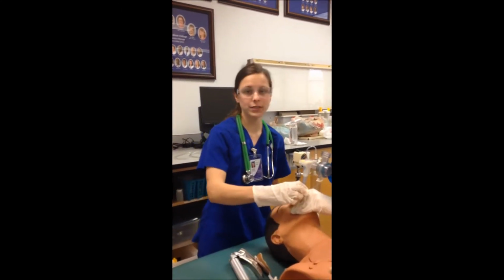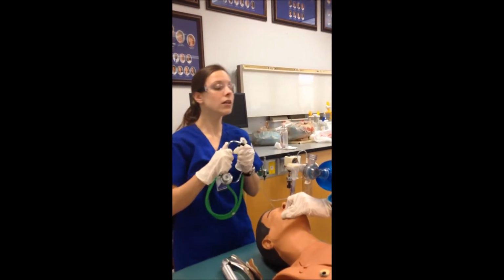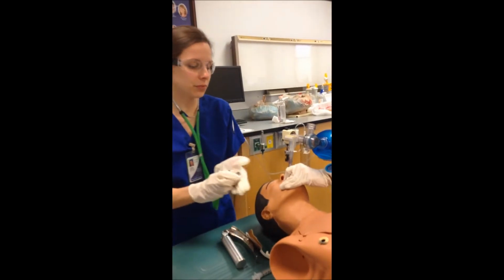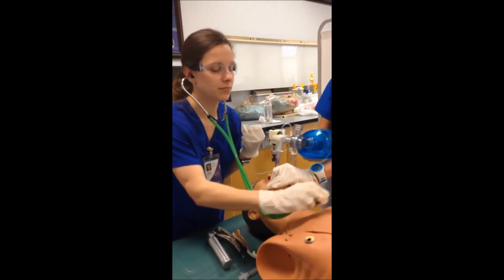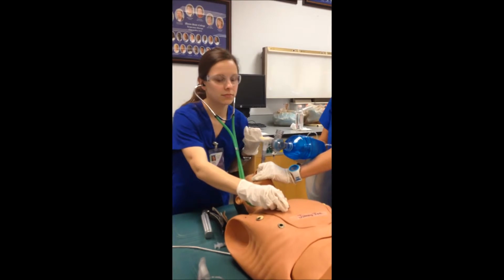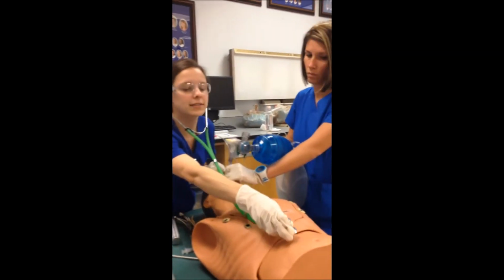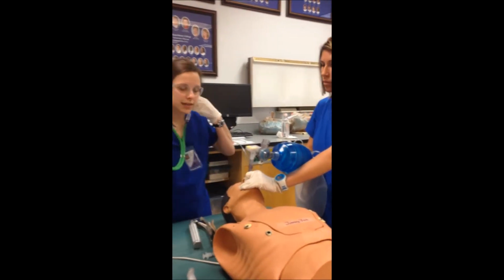We will measure the cuff pressures later. 22 at teeth is ideal, so we're not going to move. I'm going to auscultate. Color change at the CO2. Color change CO2. Also, second method for placement. Bilateral breath sounds with no epigastric sounds.